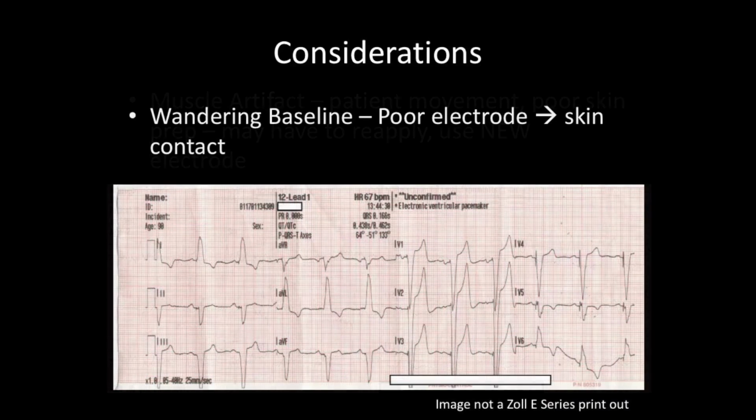Wavy baseline down here, right? It starts trailing off. Again, the computer sees a pacemaker in this, which kind of excludes any diagnostic value of this for STEMI interpretation, but you have an issue here. You have ST elevations here, right? So it requires further evaluation. Again, not our issue, their problem, right? Send it, done. And then they can tell us what they want us to do.